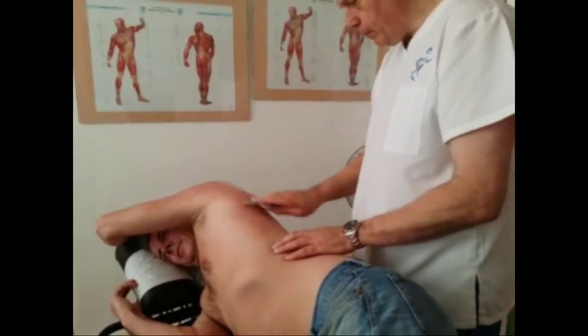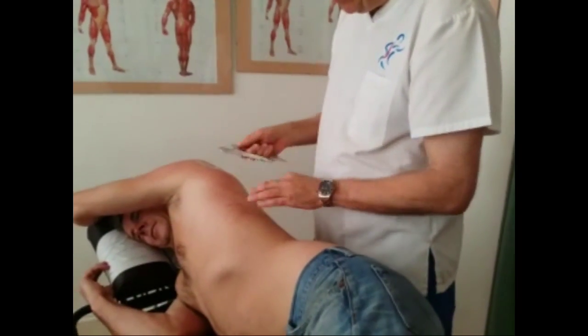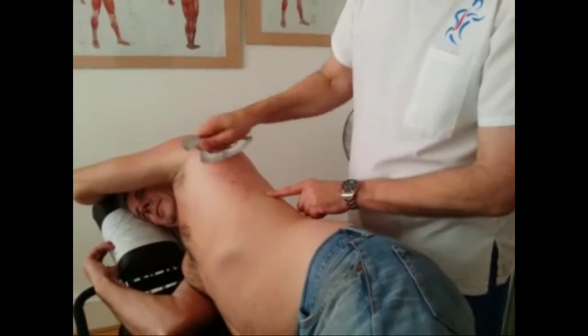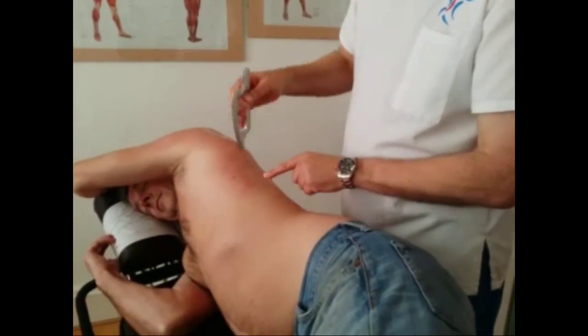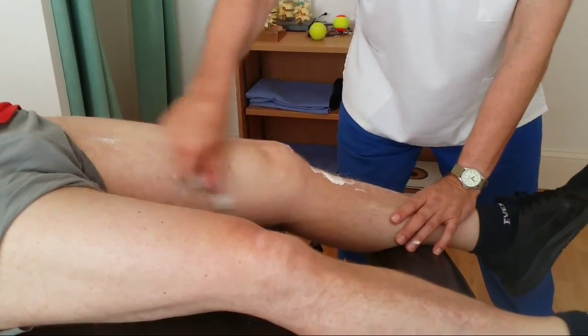To perform slightly deeper work, simply turn over the concave edge and use the convex edge. Here we see the instrument being used on the quadriceps and the medial thigh and knee. Note the instrument's ease of use.